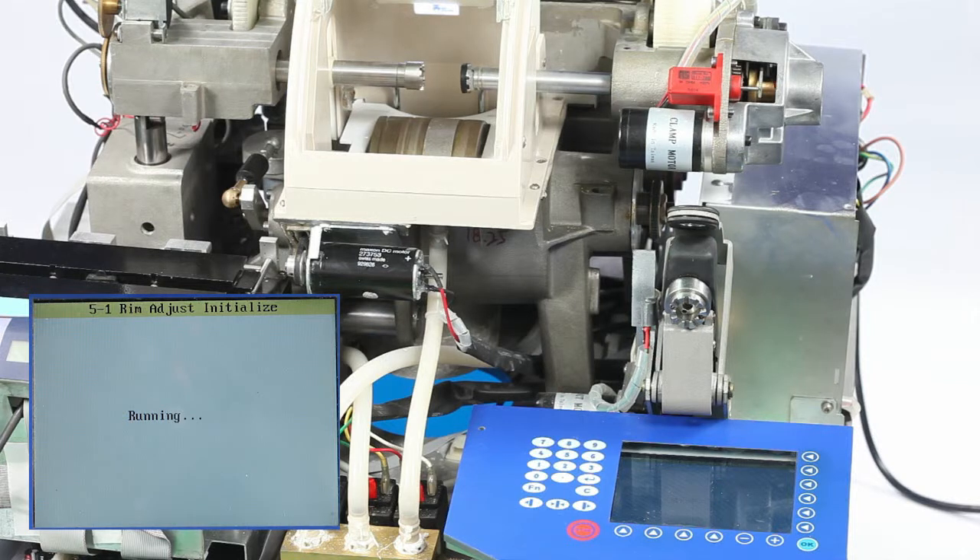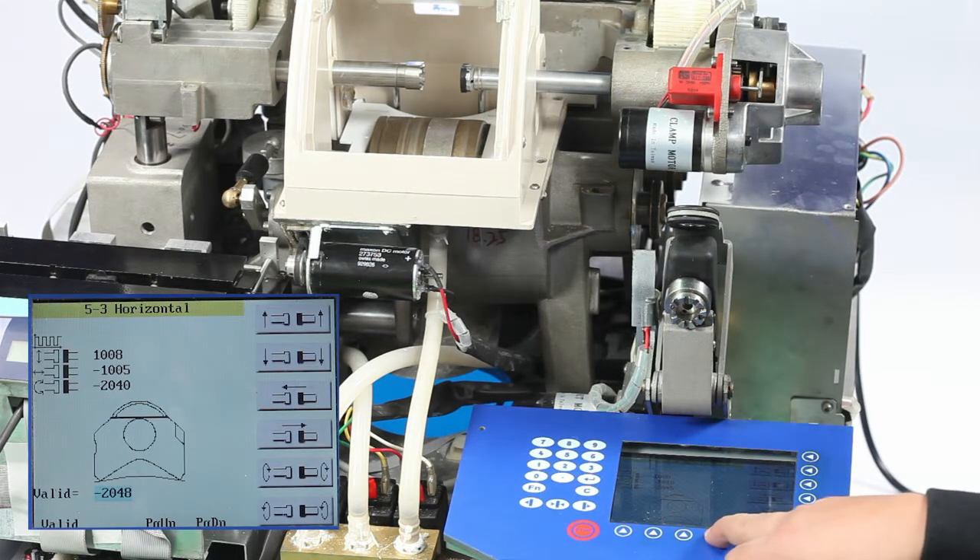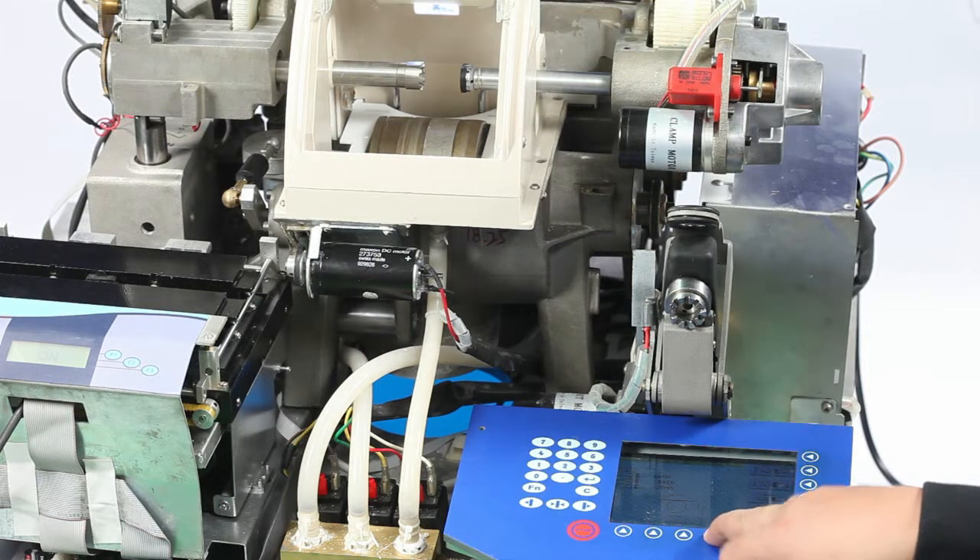Press P down to enter the horizontal axis calibration interface. Press P down again to enter the v-grooving position and KT value calibration interface.